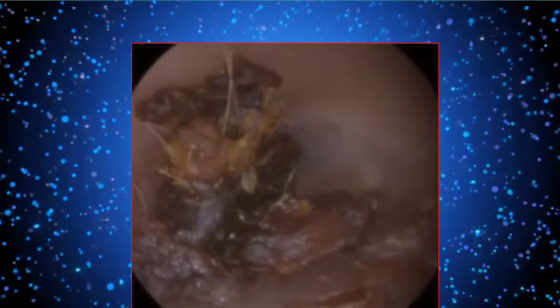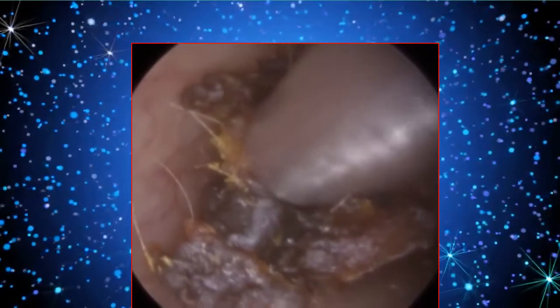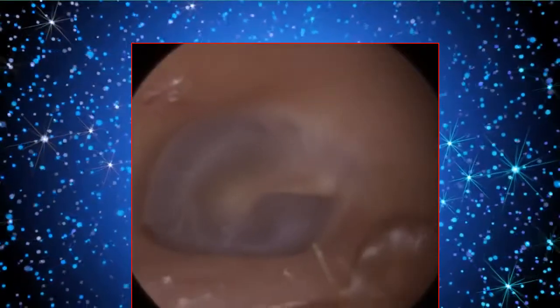This type of wax, because it's got a rough surface, can rub against the canal wall when the patient talks or chews. When you open your jaw, your ear canal widens up to the second bend, so about up to a centimetre into the ear canal, the cartilaginous portion. And when you really clasp your jaw, you somewhat contract your ear canal, you narrow it. So when the patient talks or chews, when the ear canal goes up and down, it can be rubbing against the surface of this dry wax, which can be a bit uncomfortable for the patient.